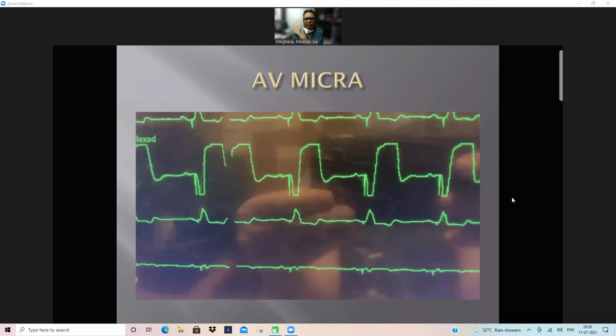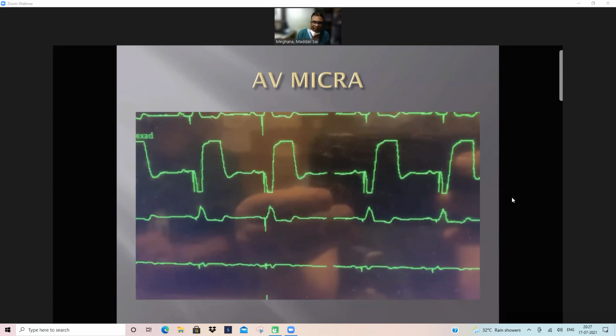And you get this kind of AV synchronization, almost to the tune of 90-95%. And those who believe that 95% is good enough, it's for them. And those who do not believe in 95%, those who may not get satisfied with 95%, it is not for them. You should go for a completely conventional pacemaker.